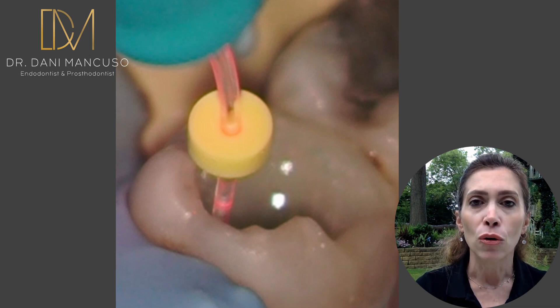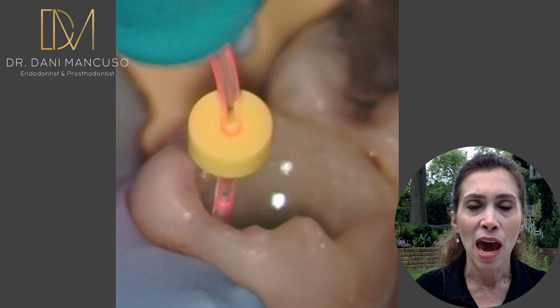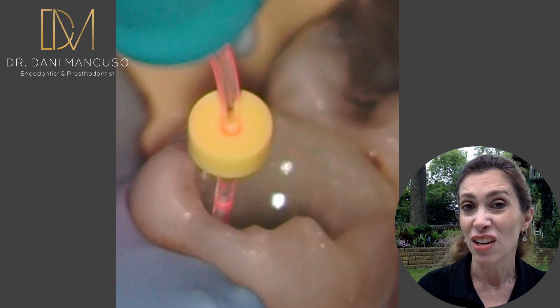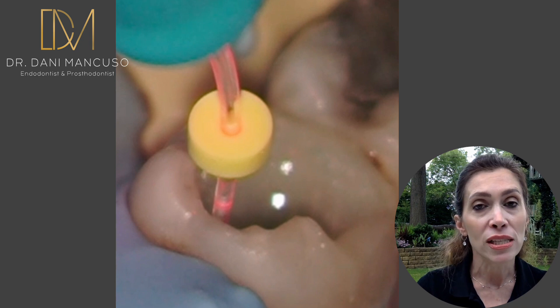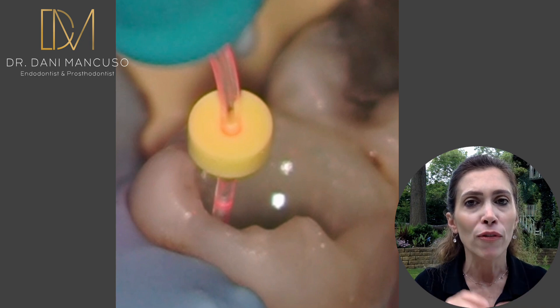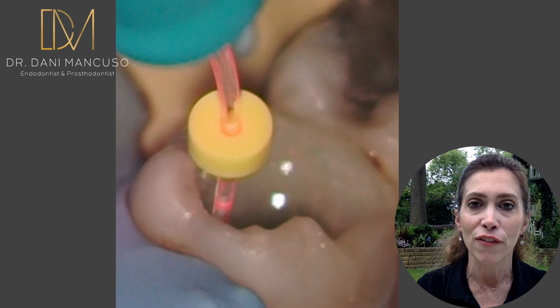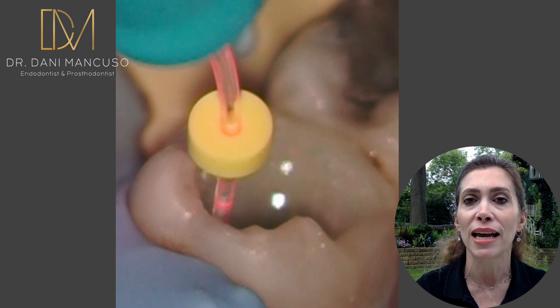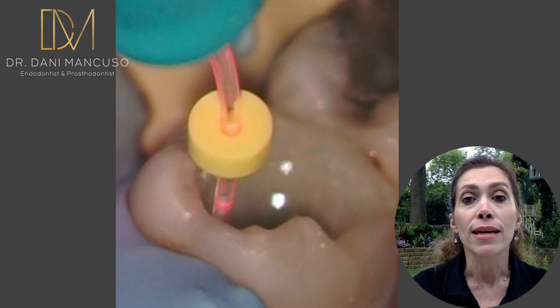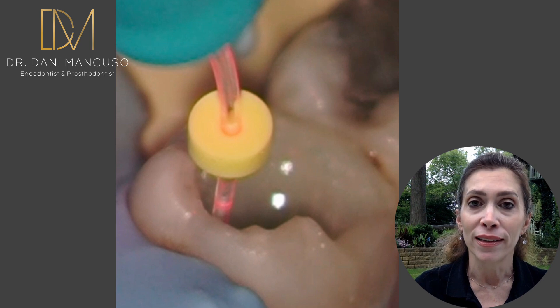But if you think about why you use the EDTA, everybody tells you it dissolves inorganic tissue. You see the sodium hypochlorite and the bubble formation — that's slightly easier for you to understand. But the EDTA, you don't see anything. And the thing is, with the laser, you won't see it either.